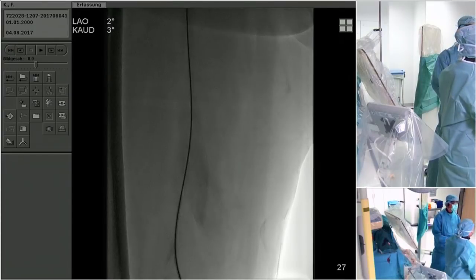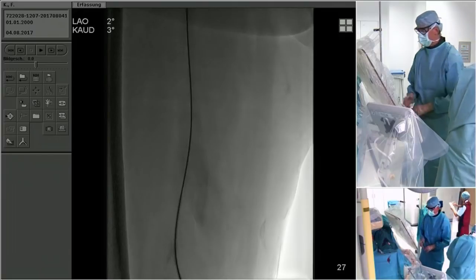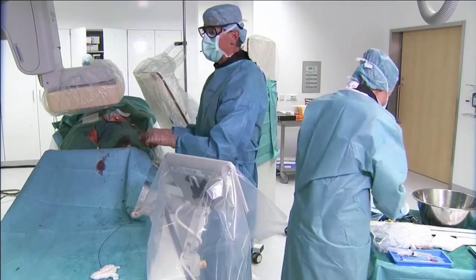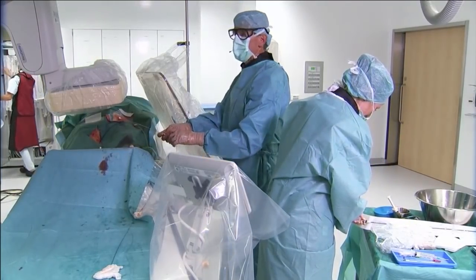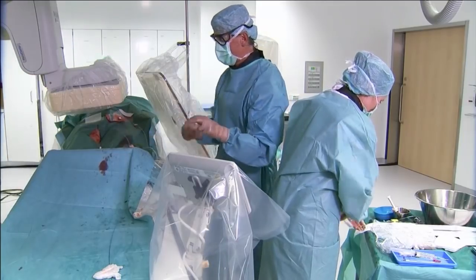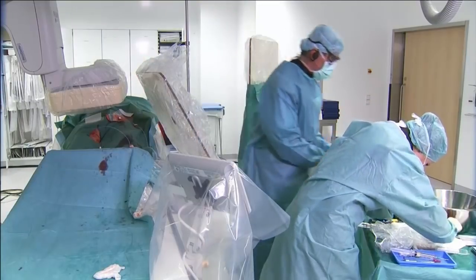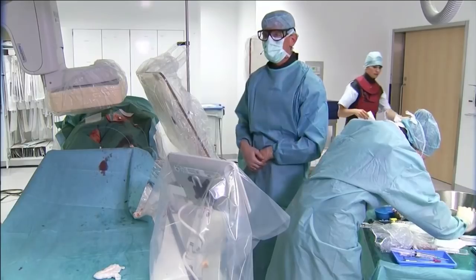Let's say a 5 French 55 cm. It would be a 5 French 55 to have better access. A short Supercore. So, Andrej, we just want to let you know that you have 20 minutes just to keep you on track. So.